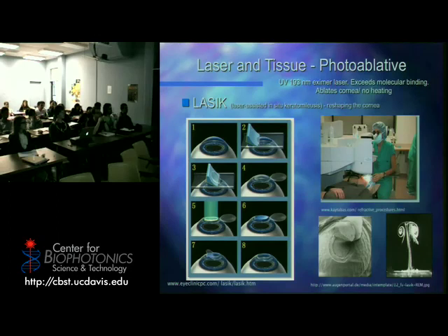Well, we take your eye, we don't take it out, you're just laying down like this, and first you slice off a piece on top of the cornea. It's called the flap, and you flap it over. Then you come in with your laser, and the laser isn't really this wide, but that's the area it's going to affect. As it scans, it can control how fast it's pulsing and for how long. It removes a layer of about 10 microns, like a layer of cells off your cornea.